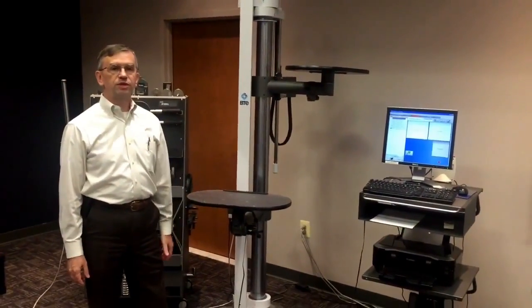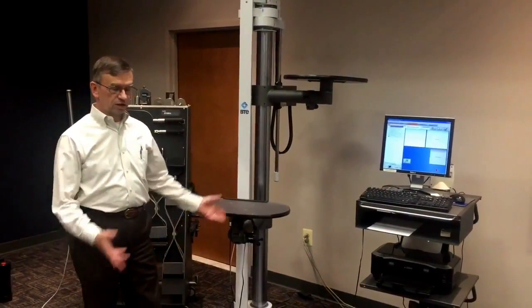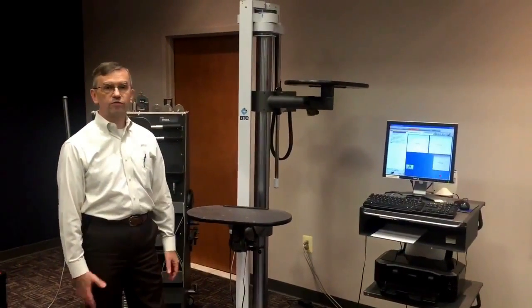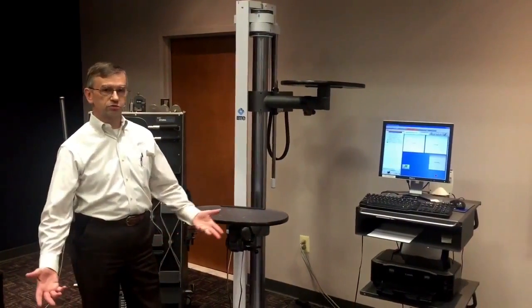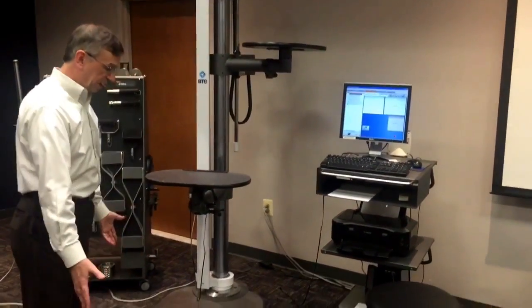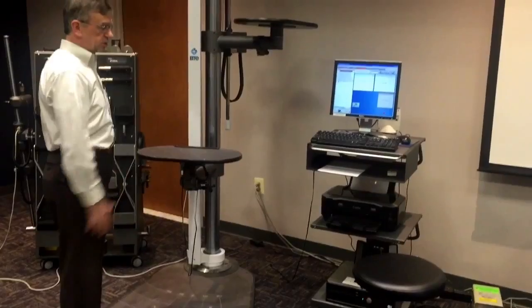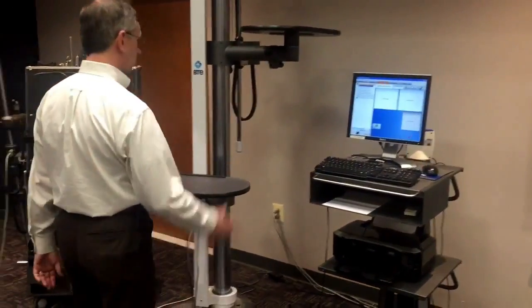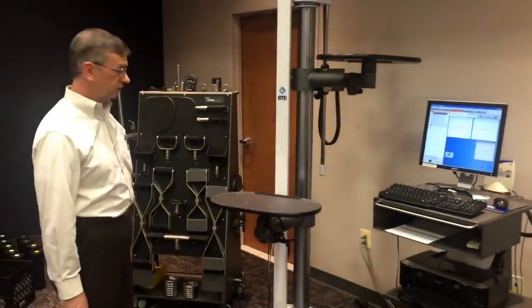This is the BTE EvalTech system, a complete system for functional capacity evaluations, post-offer employment testing, general strength testing, and range of motion. I'm standing on the base with the shelving system. Over here we have our computer cart for data collection. The computer system does come with the EvalTech.